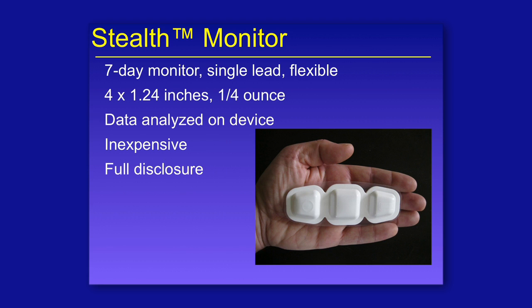I should mention that the reason I call it the stealth monitor is because in the original concept, I was thinking about how small can I make this? And I was thinking, well, this big box, what if I made the box completely disappear? You still have to have something hooked up to the chest. You have to have some electrodes. So what if you make the box disappear and all you have is the electrodes? Well, that is what we have here. And so the box is a stealth box. It's completely disappeared. It's invisible. All you have is the electrodes.